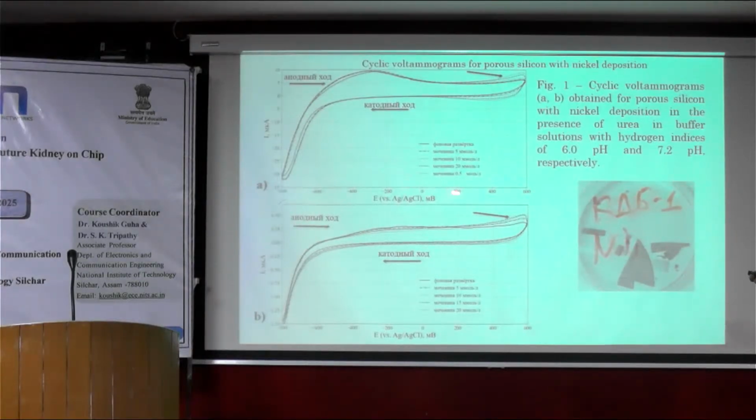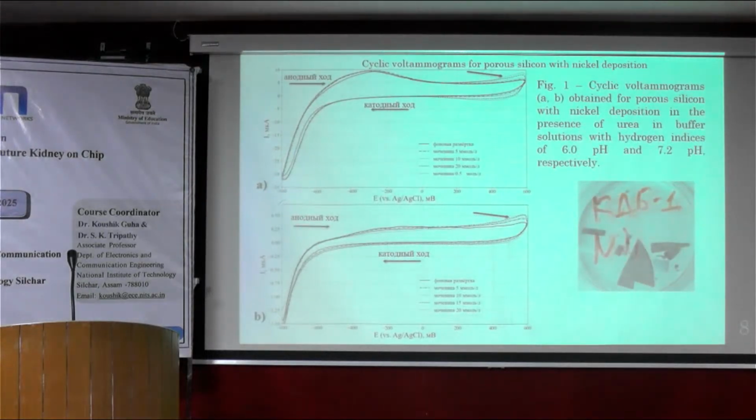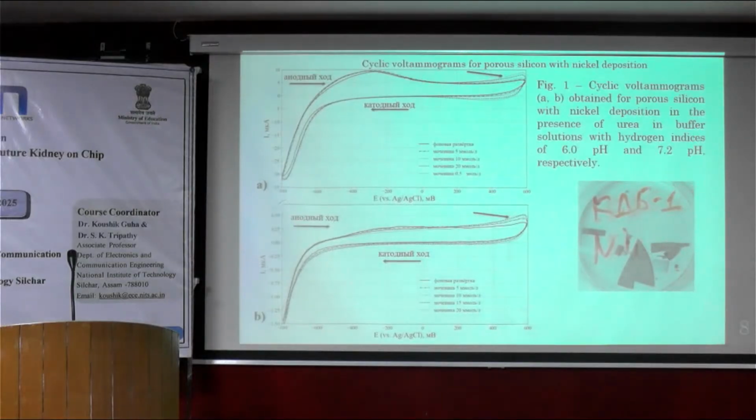And basically, if we go to the anode part of this cyclic voltammetry, we actually observe that there is a slight change of the current that we acquire from the surface of the electrode material. So basically, in terms of small concentrations, cyclic voltammetry can potentially be applied in that manner, but there is a very huge issue that we need to preliminarily calibrate this particular electrode.